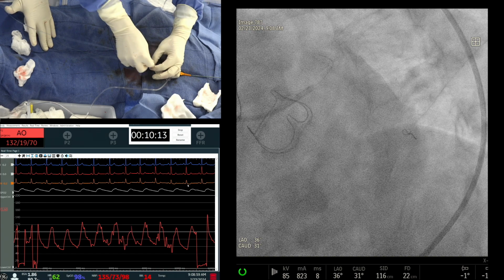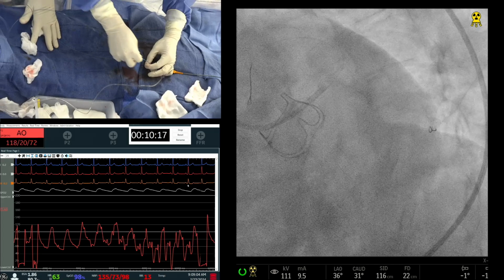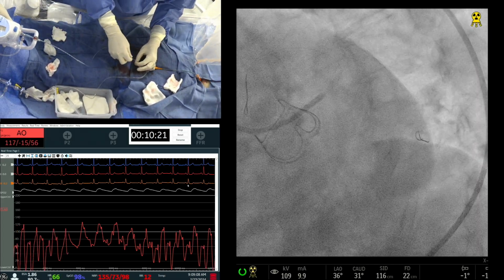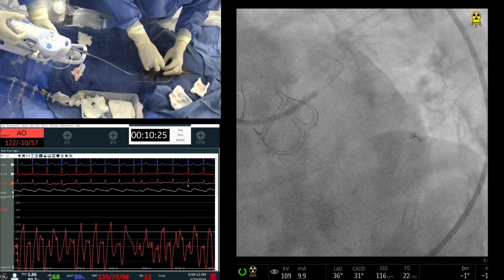And the classical is the diagonal. So very rarely we do the Rota of the diagonal now. If need be, a little balloon or IVL is reasonable, because that's where the maximum perforation of the Rota occurs. Right. Okay, now we are doing the IVUS of the LAD.